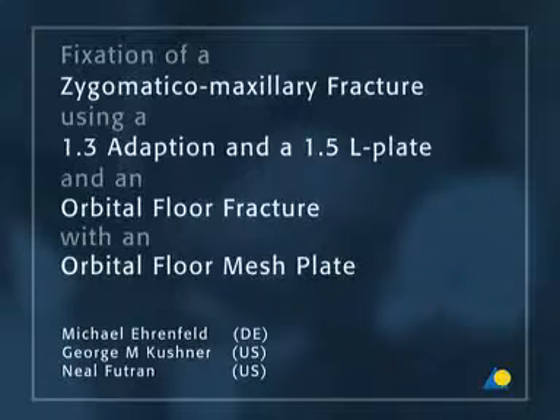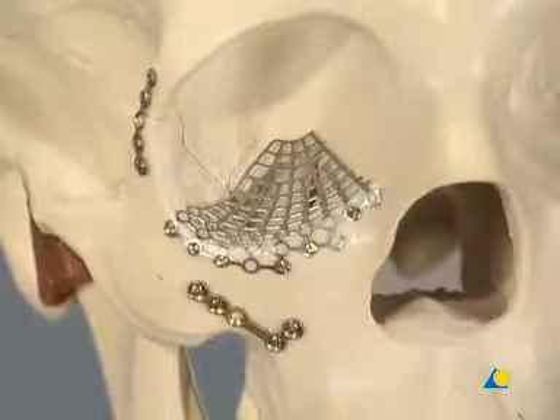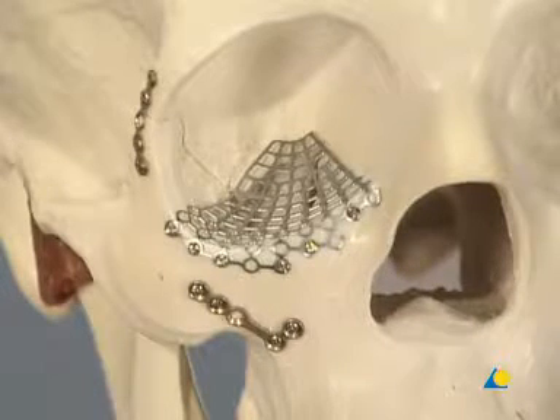This presentation will demonstrate the surgical technique for the fixation of a zygomatic maxillary fracture using a 1.3 adaption plate and a 1.5 L plate. It will also show how an orbital floor fracture is repaired with an orbital floor mesh plate.